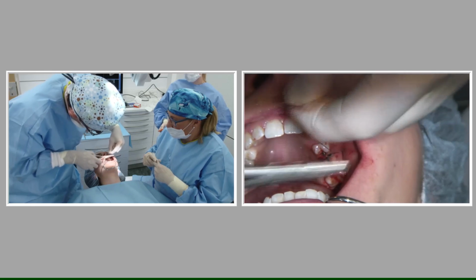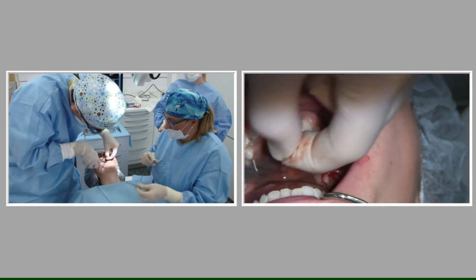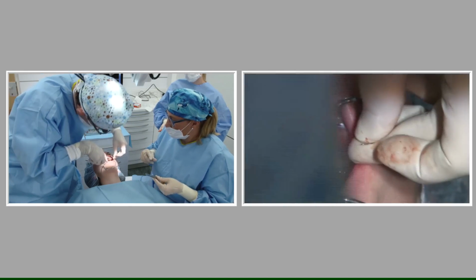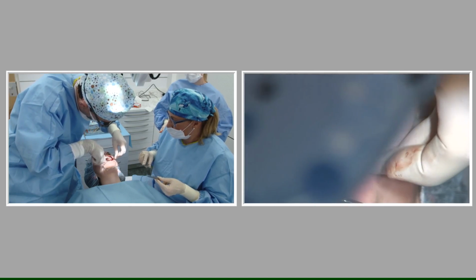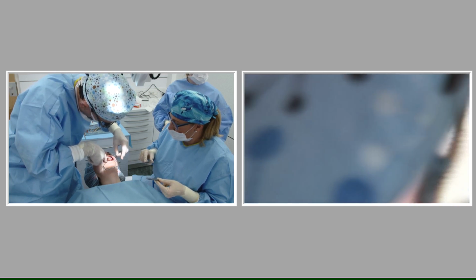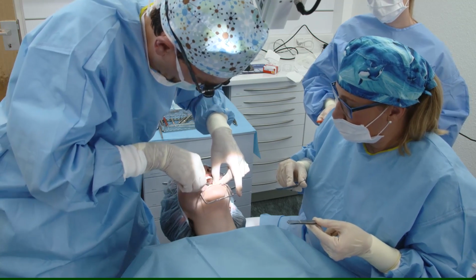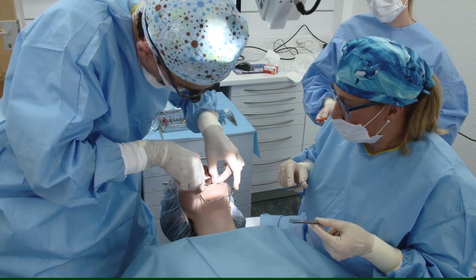But in this case, we always have, let's say, the risk that we have a weak bone quality, especially in the maxilla, D3 or D4 quality.